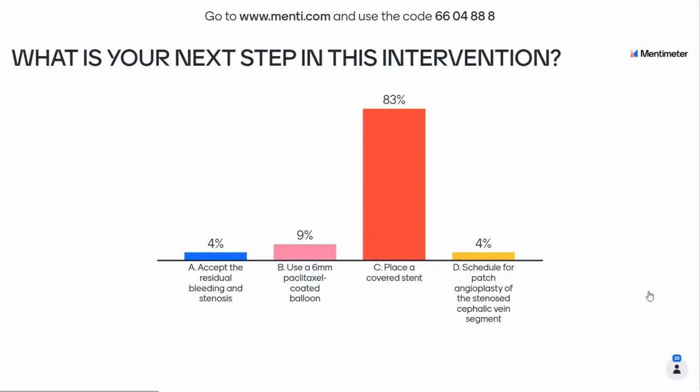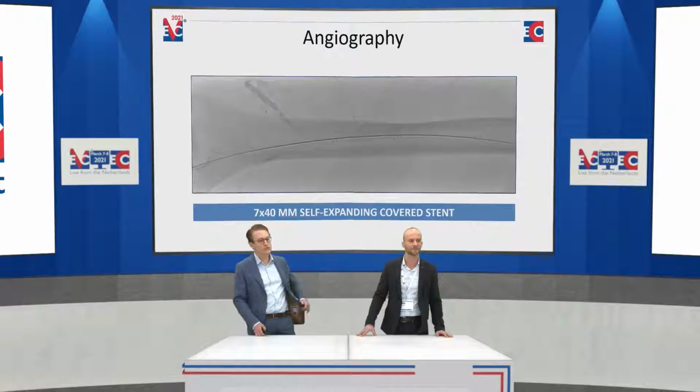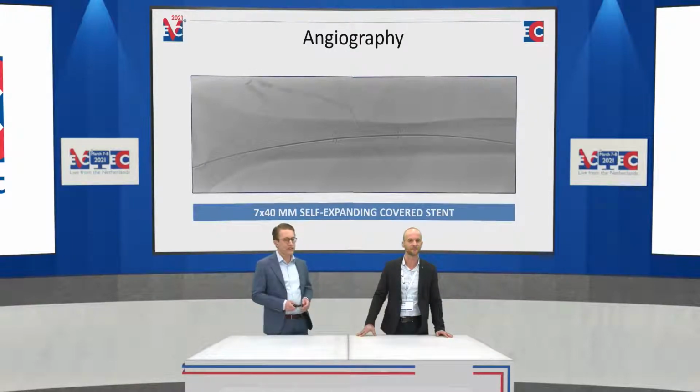Okay. Almost everybody agrees we should place a covered stent, and that's exactly what we did here. So we placed here a 7 by 40 millimeters self-expanding covered stent, and I think the result is nice as it is now.